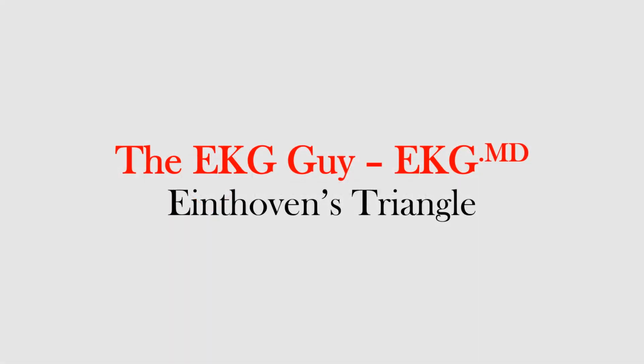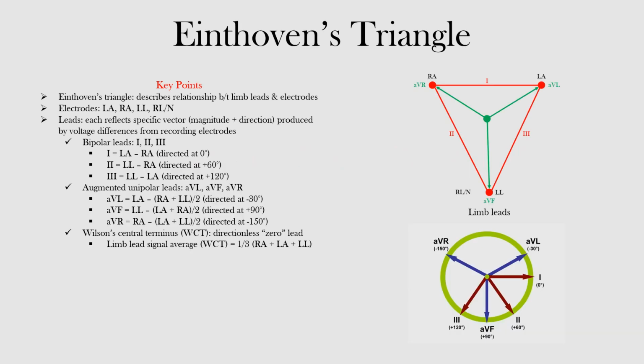In this lecture, we will discuss Einthoven's triangle. Einthoven's triangle describes the relationship between limb leads and electrodes. There are four main electrodes used: the left arm, the right arm, the left leg, and the right leg, or neutral electrode. So if you look here, we can see them.